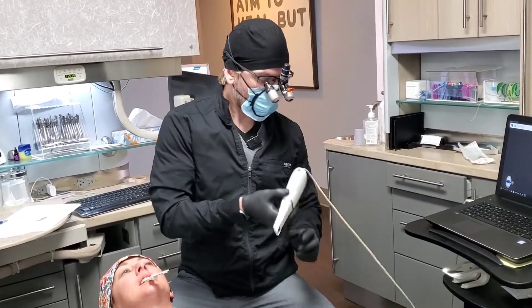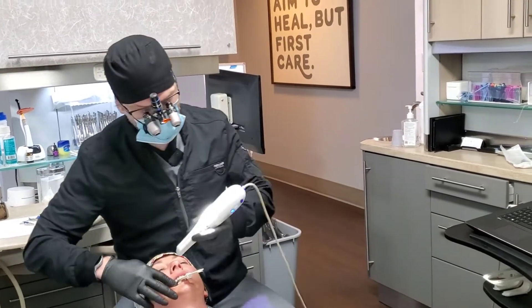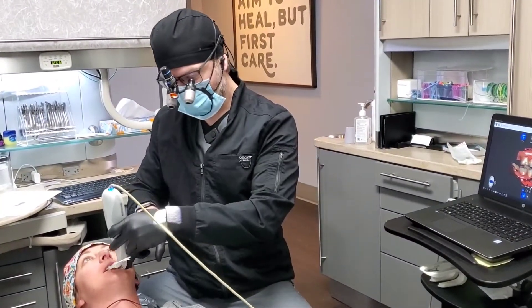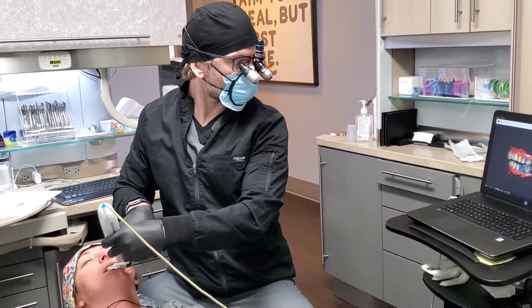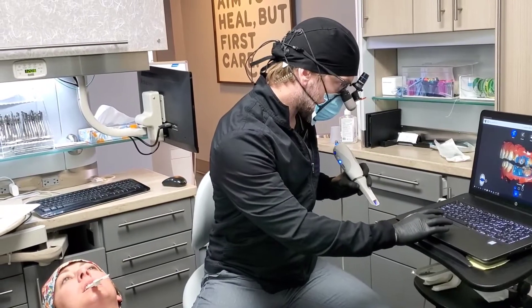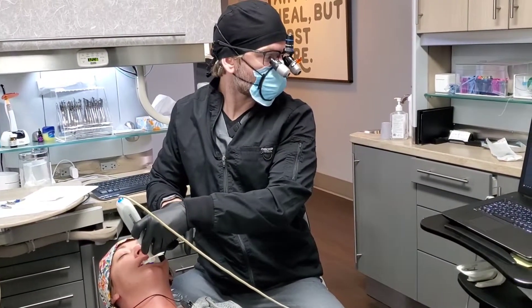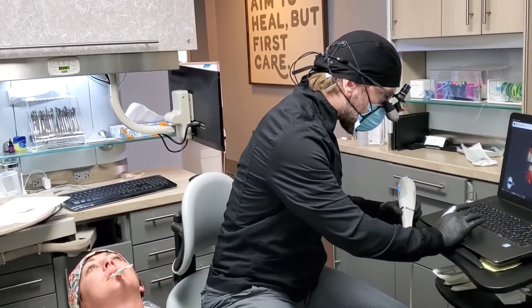So now I've got this — I'm going to go ahead and grab my camera. I'm using the CareStream CS3600, but whichever one you're using, ideally it can scan two bites, one on each side. Stay together. Because it's an open bite, it can be a little tricky since you've got dead space between the teeth. I'm going to trash that one — I can tell I just don't like it because it doesn't seem to stitch very well in those lower premolars. It's important to actually look at those to make sure it doesn't look like a terrible stitch. It's a little better — still a little bit off, but between the two of them we should be good.